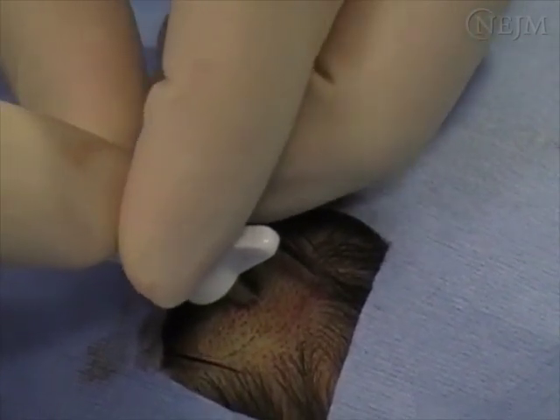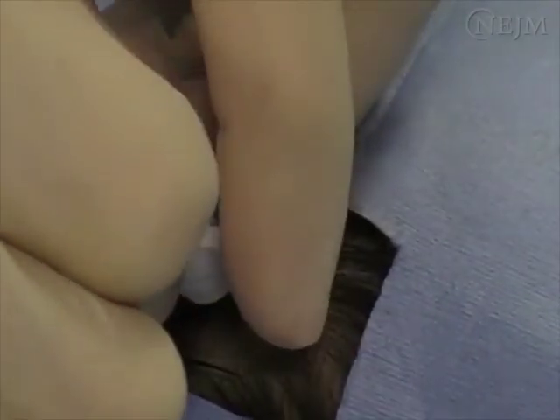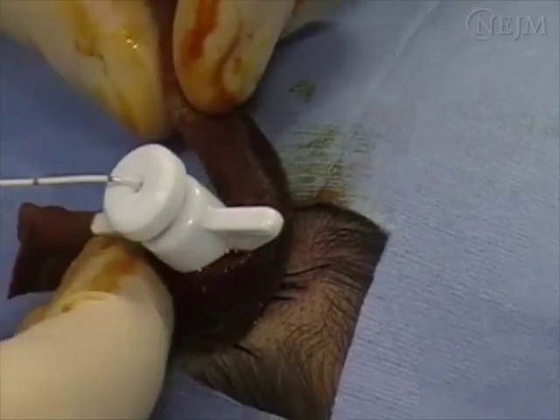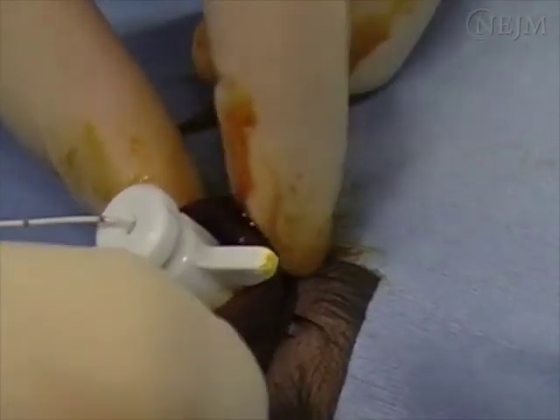When a strain gauge is used, a bend may be placed in the sensor at the desired depth, but other types of sensors should not be kinked. Dress the wound site using antiseptic-soaked gauze. You may place a purse-string suture, which can aid in wound closure after the bolt is removed.